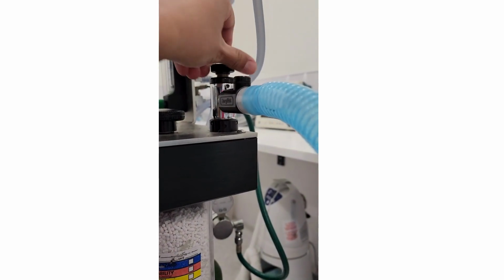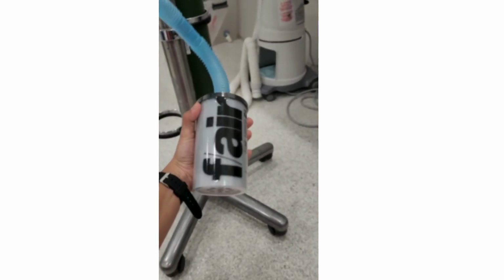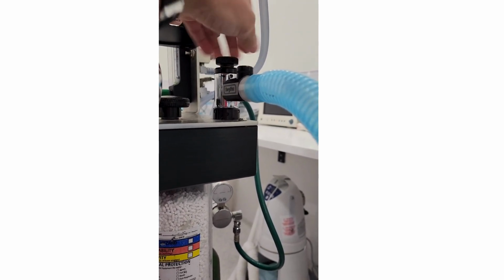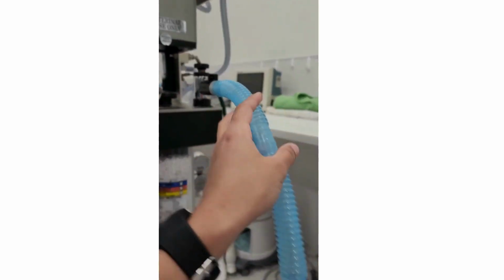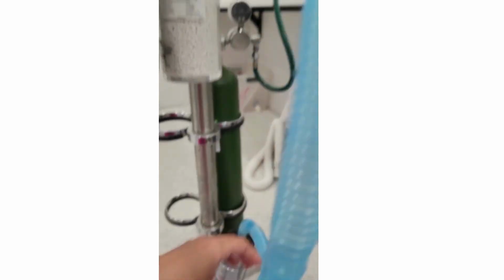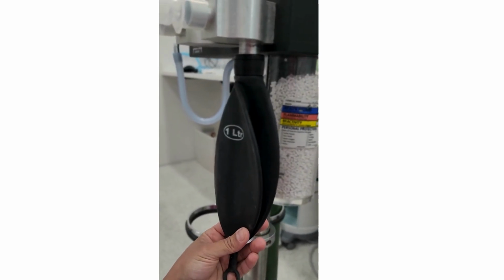Then we also have the pop-off valve that allows the excess pressure in the system to escape via the scavenging system, where the waste anesthetic gases will be neutralized. This is a passive scavenging system, and it should be discarded after it gains 50 grams from its initial weight. Then we have the CO2 canister that pulls CO2 out of the circulating gas, and the reservoir bag that will catch excess gas from the system.